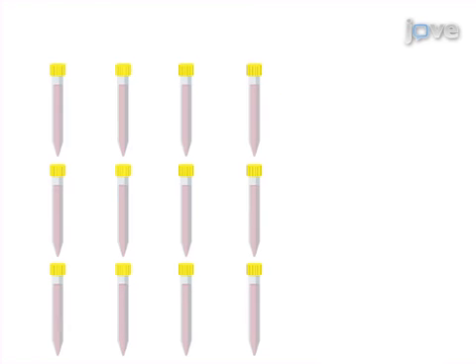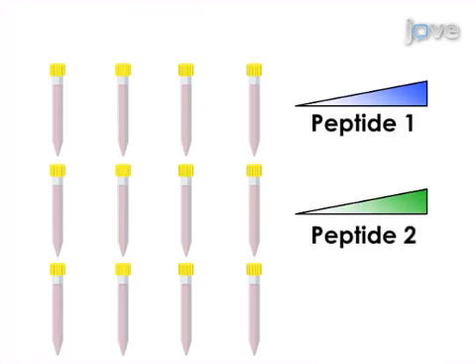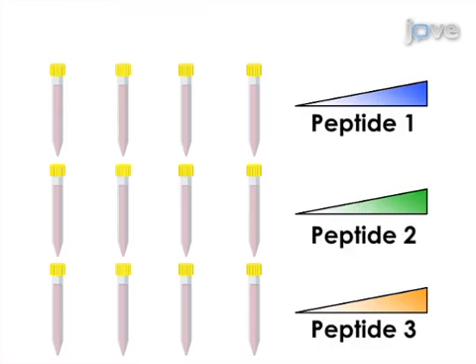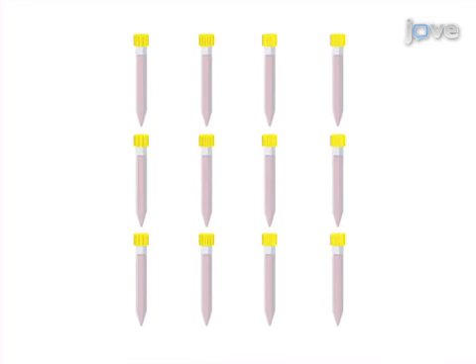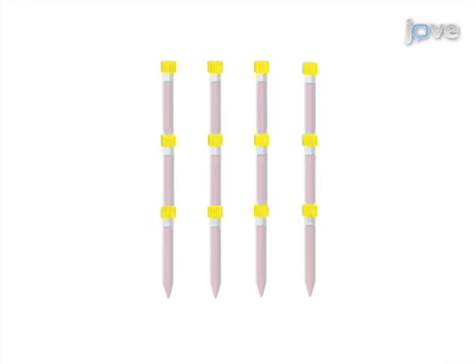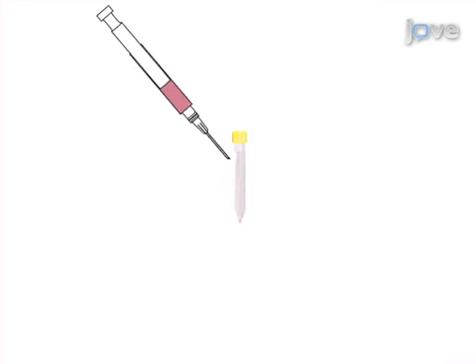CTV. The next step is to pulse each distinct target lymphocyte population with candidate MHC class I and MHC class II binding peptide epitopes. This is followed by extensively washing the cells to maintain the specificity of the epitopes, and then pooling the cells and injecting them into an animal.